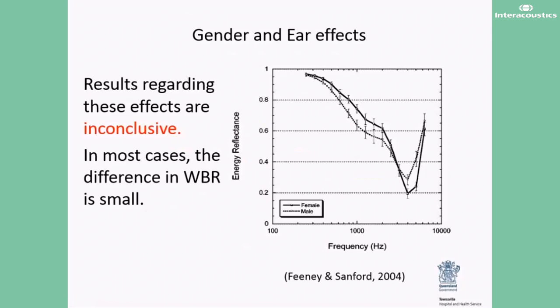Similarly, the difference between right and left ears is also not conclusive. Some infant studies have shown significant differences between ears, while other studies have not shown any significant difference between the right and the left ears.